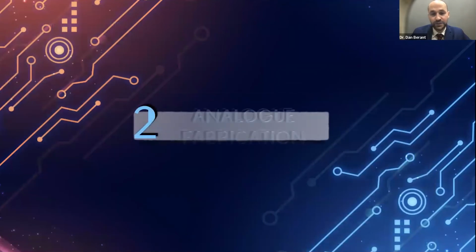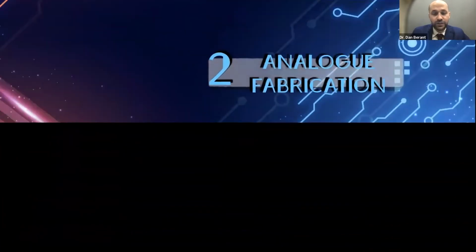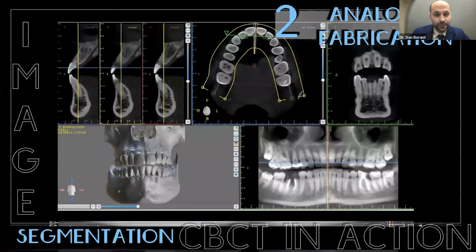And so that brings me to the analog fabrication. We start off with a CBCT. And once we obtain the cone beam CT, and the reason we take a full view is to determine which tooth is the best recipient for the particular case.